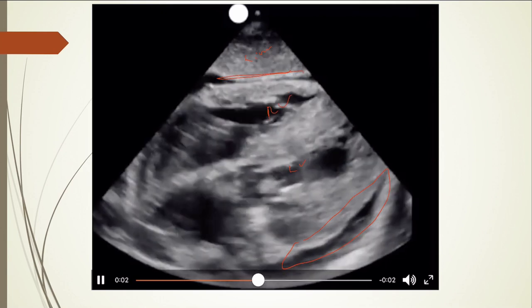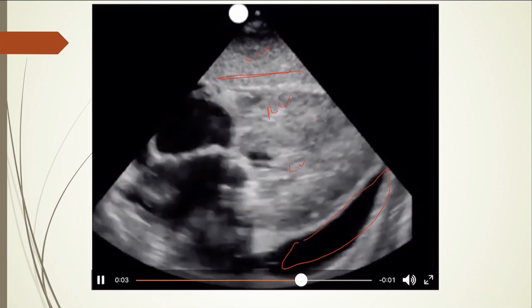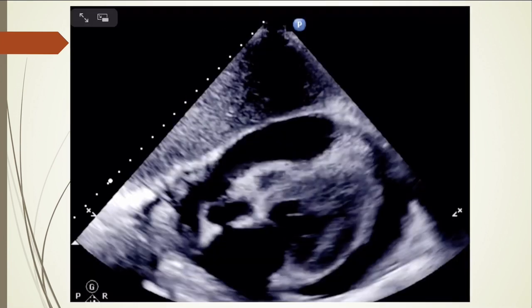So this patient, let's get this to stop, could stand to have a pericardiocentesis done as well. This is definitely positive for effusion and tamponade. And here's a still that, again, it's not the best picture, but you can see the dark anechoic fluid all up in here.